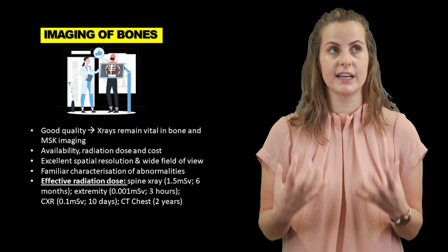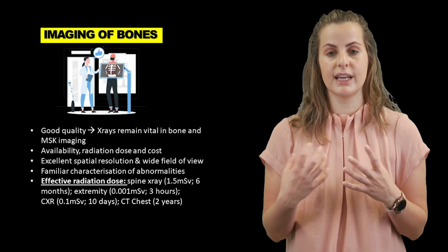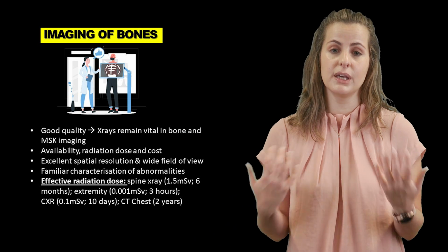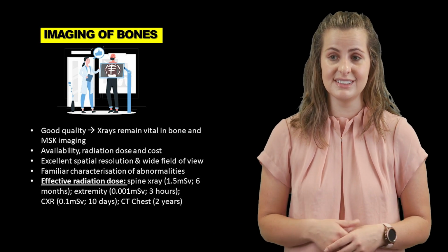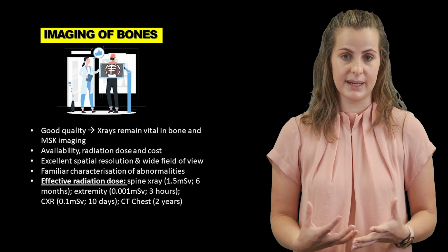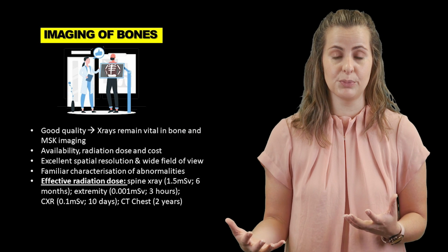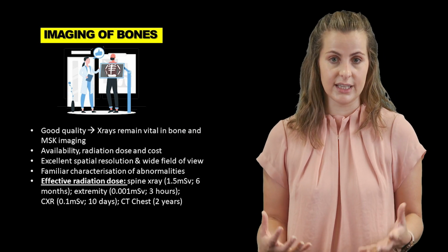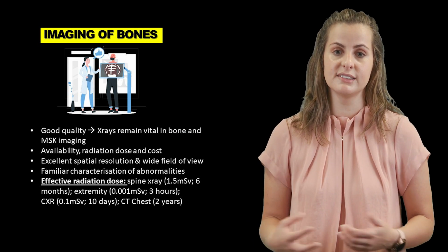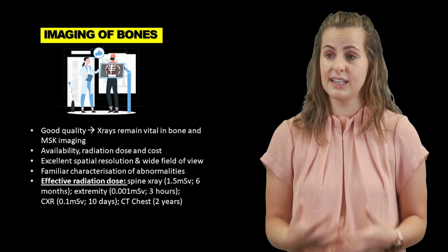If we're thinking about effective radiation dosage, it's important for you to remember that the amount of radiation that the patient is exposed to is going to depend on what it is you're scanning, how big the field of interest or the region of interest actually is, and then obviously how many scans you're recommending too. So if we had to put this into perspective, usually we compare radiation exposure to the background radiation exposure that someone will receive in their everyday life. Whether this is radiation that is emitted from our mobile phones or technological devices, radiation that is emitted from aeroplanes, or just daily activities, our daily environment.